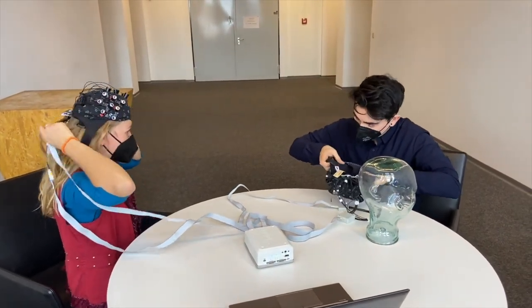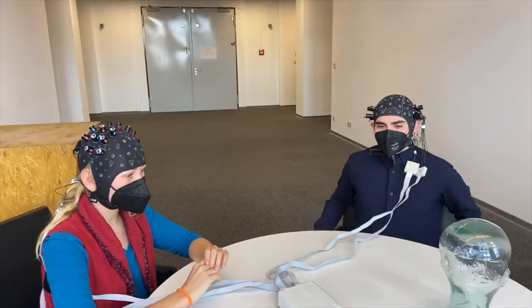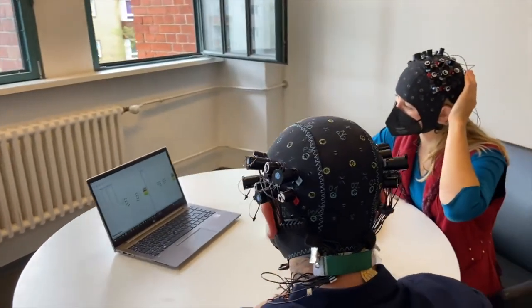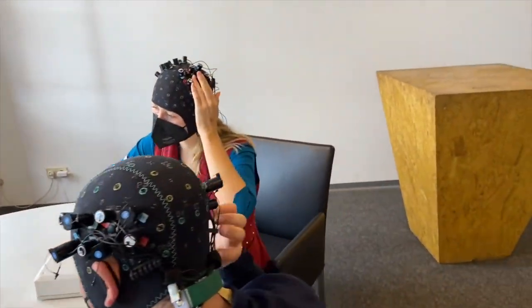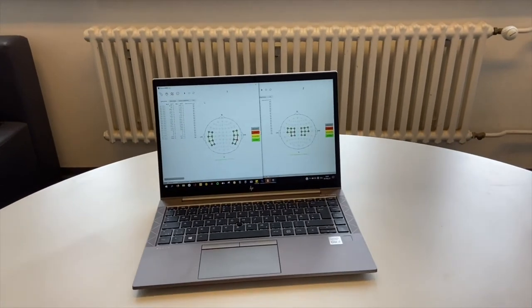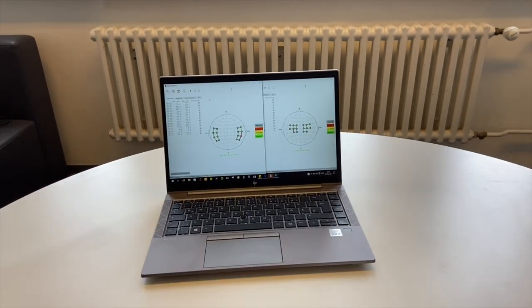Amy had the cap on the motor region and Dimitri had the cap on the temporal-parietal region. For the easy participant, we used our standard dual-tip optodes, which work wonderfully well. For Dimitri, we wanted faster setup, so we used avalanche photodiodes, which are highly sensitive, reduce setup time, and give excellent signal quality right away. The ability to choose participant-specific optodes or participant-specific solutions can really help in getting excellent signal quality.